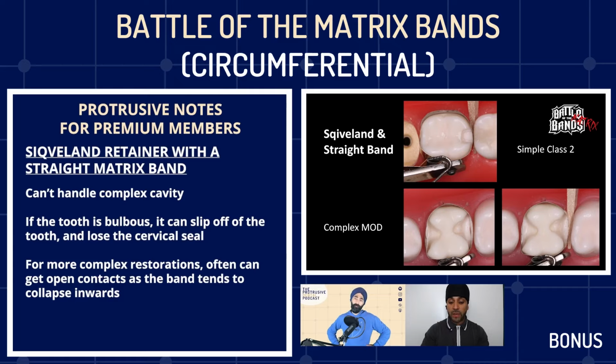And I also think we have a bit of a... Yep, so that image there is wonderful, that visual where you put the wedge through that lower right image. Yeah. And I'm getting goosebumps here seeing that. My palms are getting sweaty just looking at that, because I've been in that scenario so many times where I've taken an intraoral photo. I actually take an intraoral photo here and I say, can you see that I had to choose between your seal and it touching the next tooth? And I picked your seal.